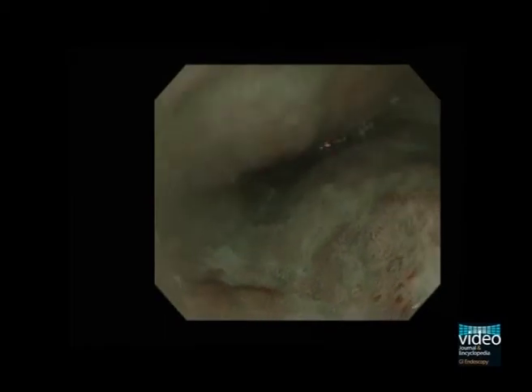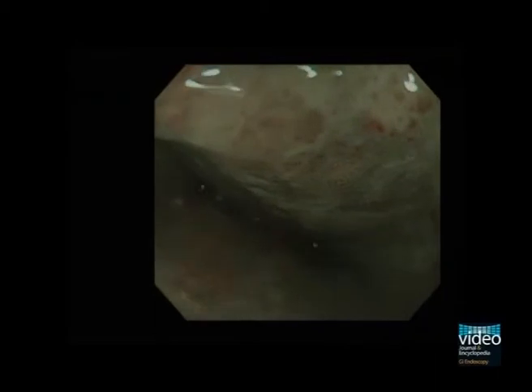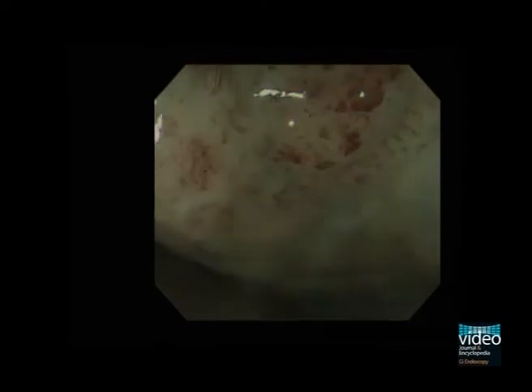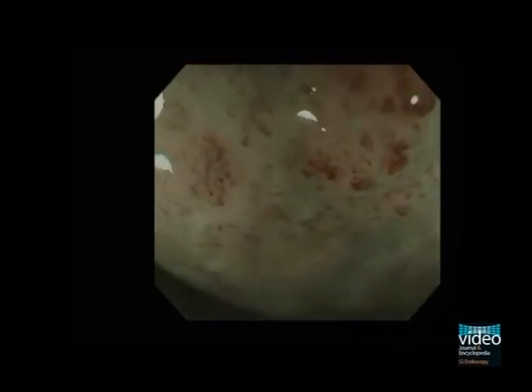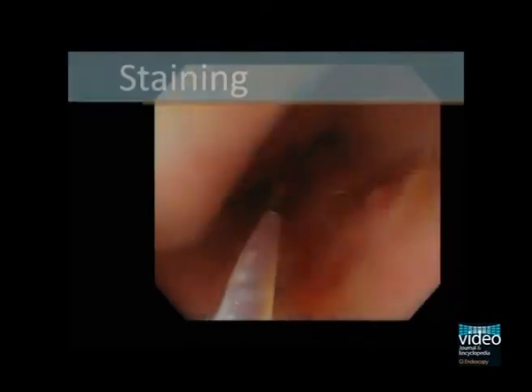For the magnifying endoscopy, we rotate an endoscope to put the tip close to the lesion. In this case, magnifying endoscopy with NBI reveals irregular, dilated and elongated intraepithelial papillary-capillary loop, that is IPCL, indicating that the lesion is a superficial squamous cell carcinoma.